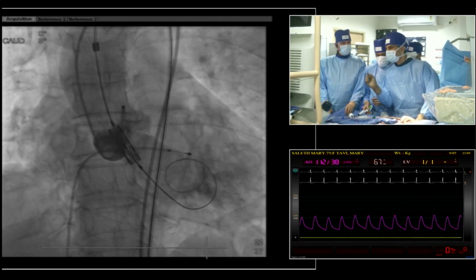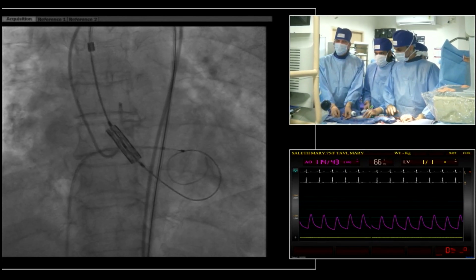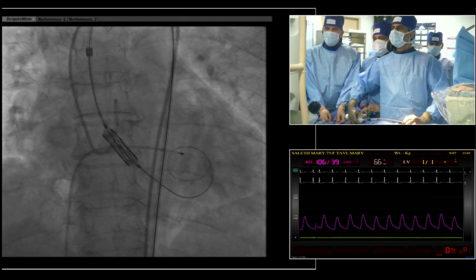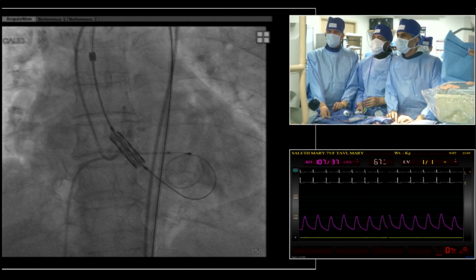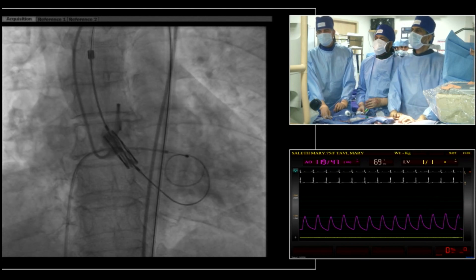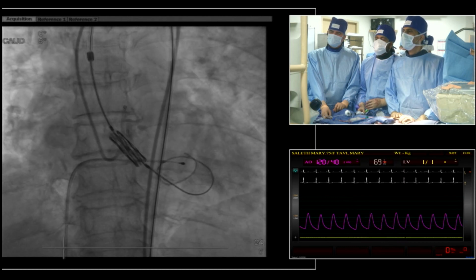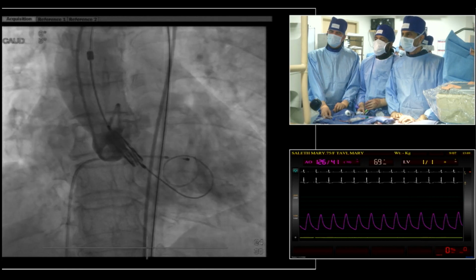Maybe a little bit lower. Slightly lower. So what do you think of position, Sengo? A little bit too high. I am happy with this position. We take another picture. Okay. Take one more. Just see what you feel. Looks good. We can see the dark zone. We can actually see that your cusp is at the second dark zone, and I would accept this as a good position.